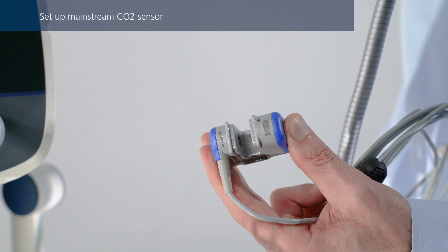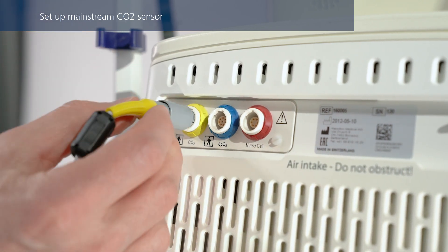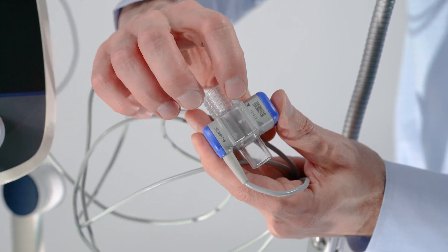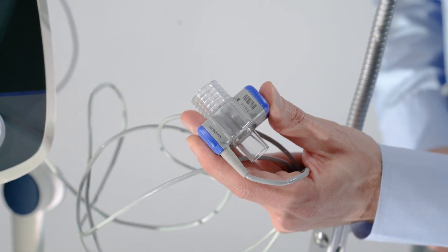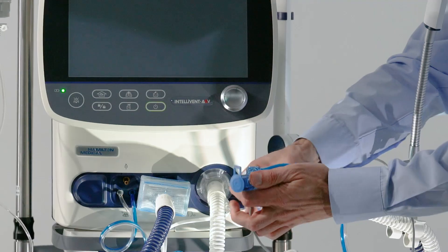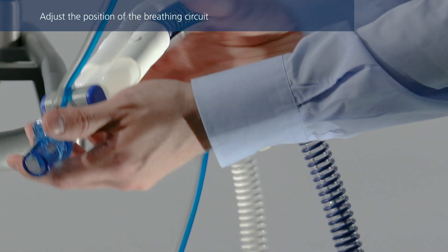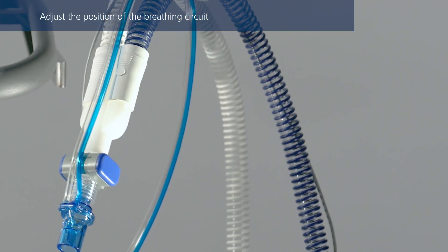If you are using a mainstream CO2 sensor, connect it at this point to the corresponding connection port. Slide the CO2 sensor onto the airway adapter. Align the arrows on both components and press them together until you hear a click. Then connect the sensor with the airway adapter to the breathing circuit before the flow sensor. Position the breathing circuit in such a way that the tubes will not be pushed, pulled, or kinked if the patient moves.